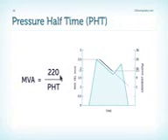So why is 220 in this formula? Well, 220 is an empirically derived value which was tested or derived in a study many years ago where they looked at patients with mitral stenosis and they performed both Doppler echocardiography and catheter and then related the mitral valve area with both methods.